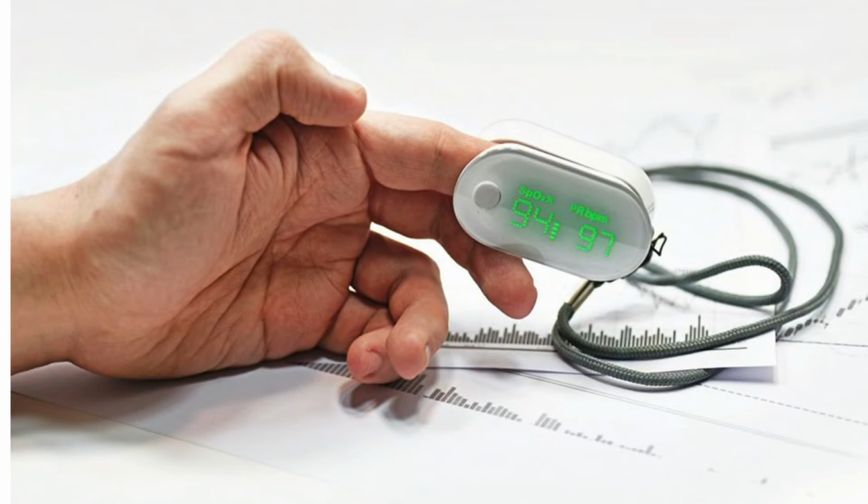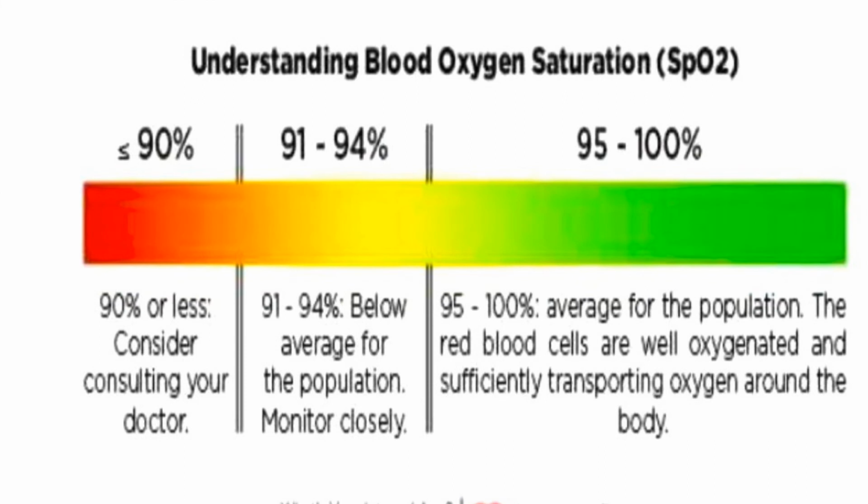The sensor is attached using various devices. One is a spring-loaded clip attached to a finger or a toe as shown. It is used when an intermittent measurement is required. However, this clip is too large for newborns and young children, so for this population, the sensor is taped to a finger or toe. This technique is also used for clients who require continuous monitoring.